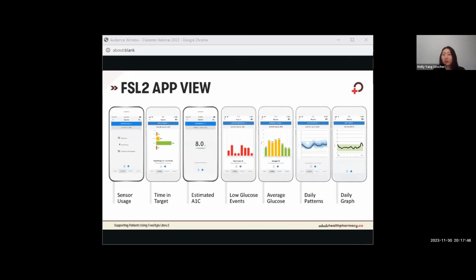If anyone's still interested, I'll pull up my full LibreView report just so you can see. I don't have the full 14 days of data on here, but you can see what's included beyond the AGP reports.